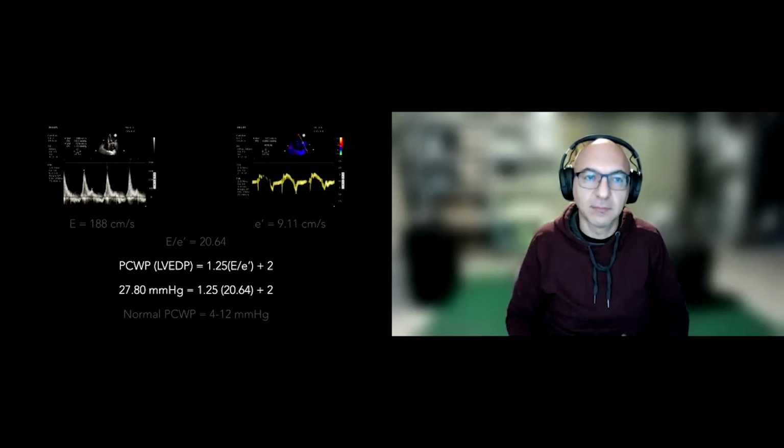So basically, what we did is we measured the E and the A waves. We measured the E prime waves. So I plugged that in to get the E over E prime ratio, which gives us a ratio of 20.64 for this patient, or let's just say 20. Then, using the formula of 1.25 times your E over E prime ratio plus 2, that equation approximately equals your pulmonary capillary wedge pressure.